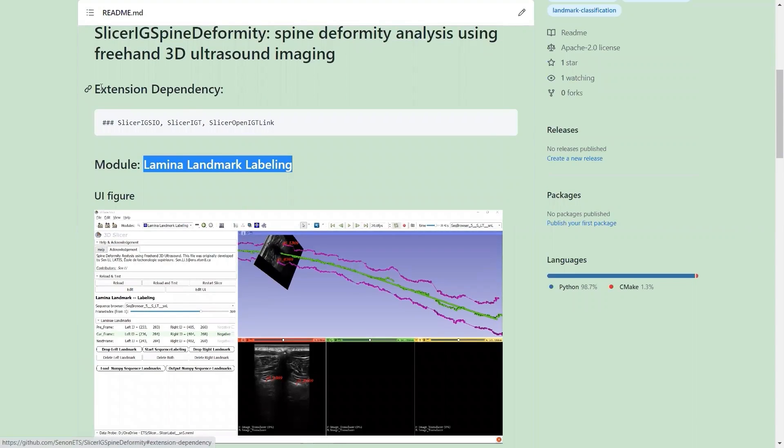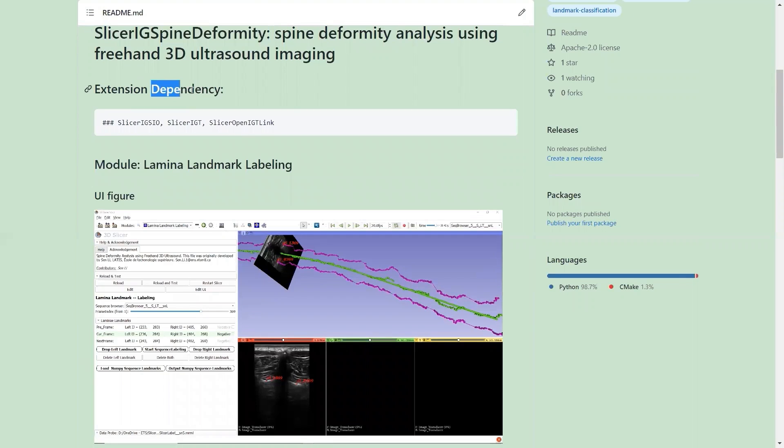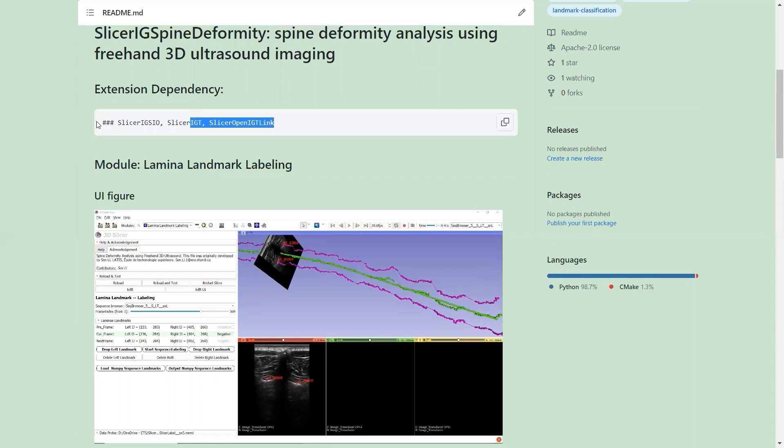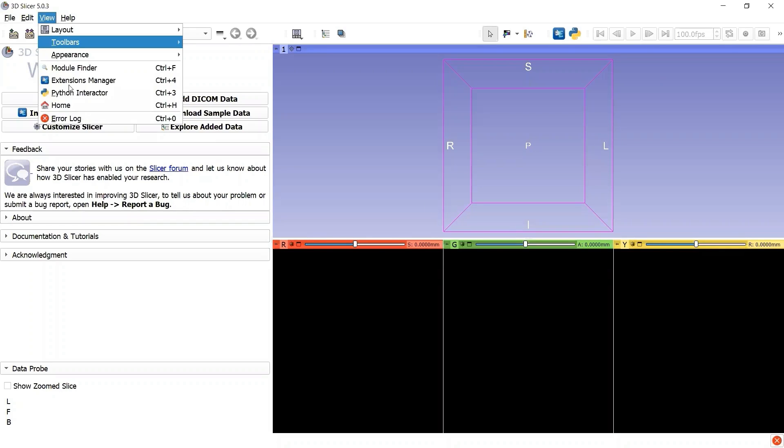Before we install the extension SlicerIGSpineDeformity, we first need to install the dependencies as written in this readme file. Let's go back to 3D Slicer and go to the Extension Manager.